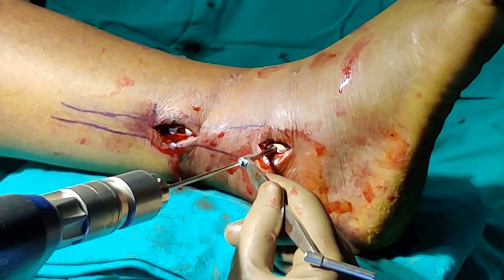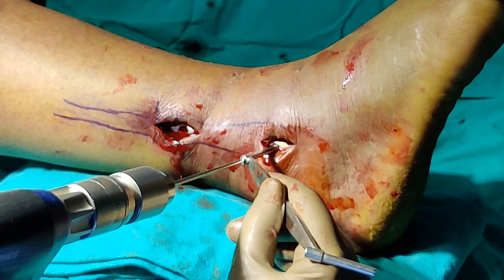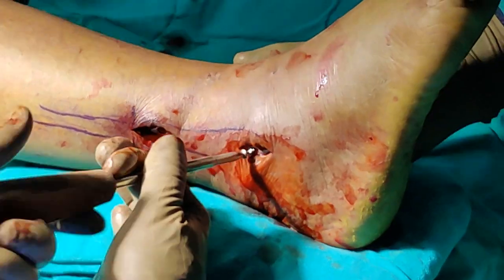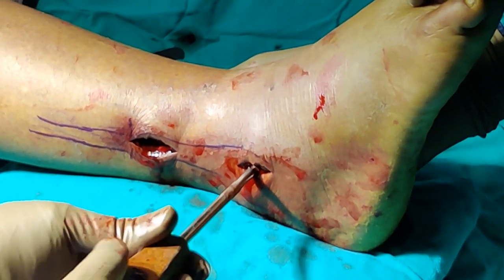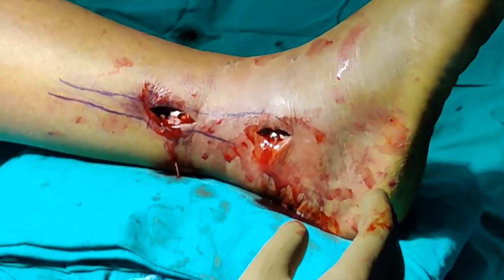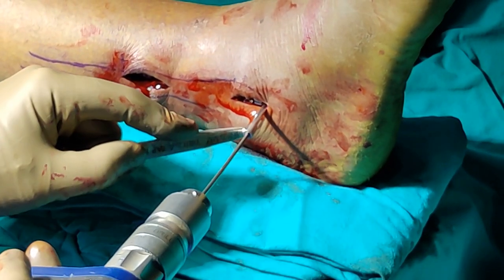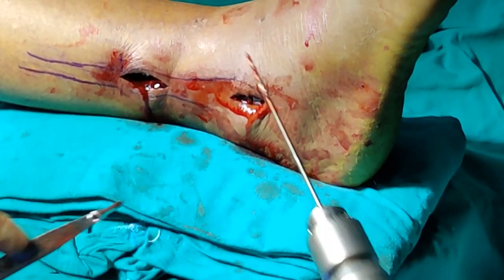You should know your sets well — we are using a small fragment set with a 2.5 drill. I am just going to make a unicortical drill because this is a cancellous area, and usually the screw size is around 18mm, so let us have an 18mm cancellous screw. I will hold the plate proximally so it does not change direction. When doing the distal screws you just need to break one cortex, and angle it — if you go horizontal the screw length is usually very small. You do not want to go into the articular surface.